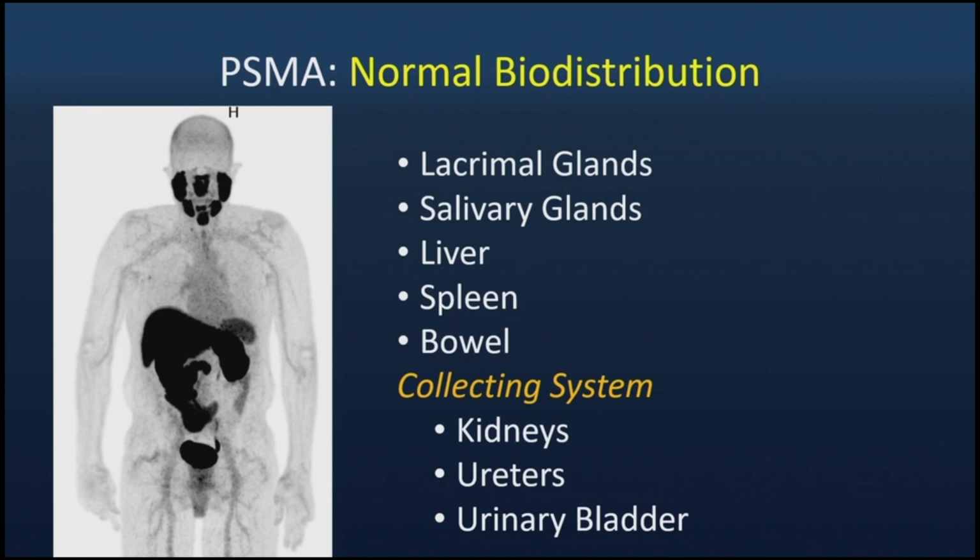And again, as a radiologist that reads these, I always have to fight what is ureter and what is a lymph node. So I always live on this MIP image, and I always do coronal and sagittal reformats, look for what's the difference between ureter and what is a pelvic lymph node.